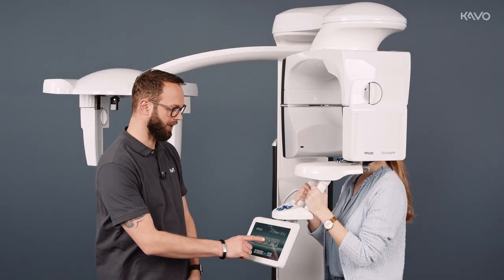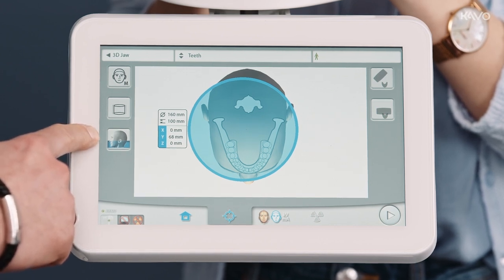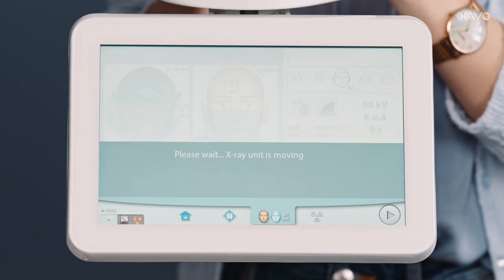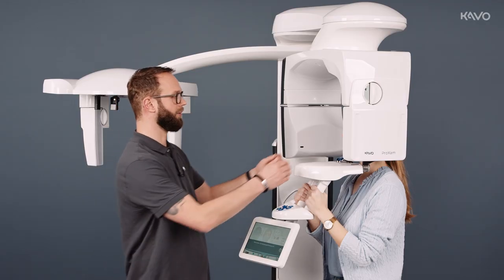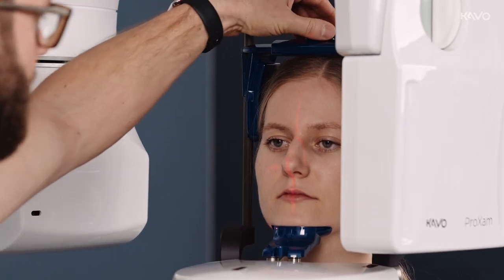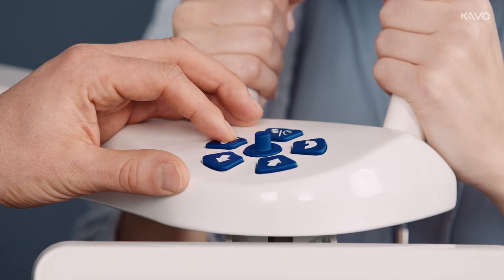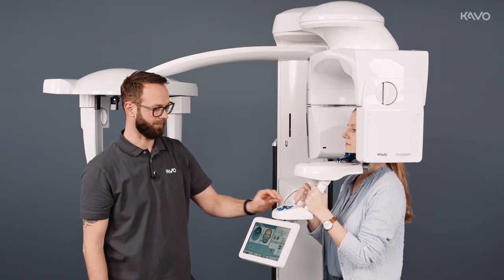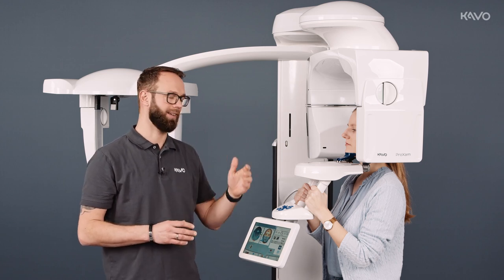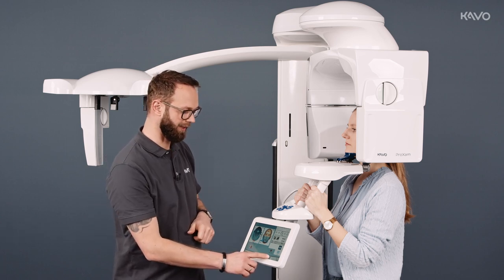For jaw imaging, we go to the jaw section on our display. You can select the upper jaw, lower jaw, or both jaws. We go to the patient positioning level, align our patient on the mid-sagittal plane, close the temple supports, and correct the volume by adjusting upwards and downwards. Since we've reached the maximum diameter of 19 cm, we don't need to position the volume laterally. We can now go straight to imaging.